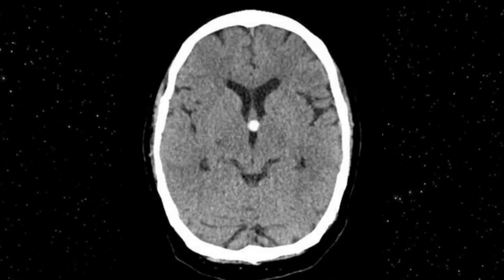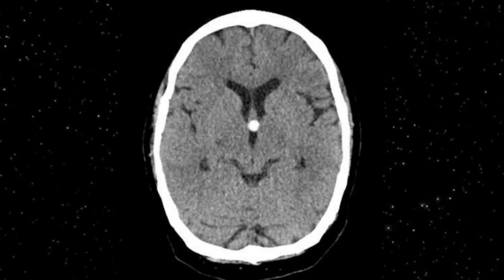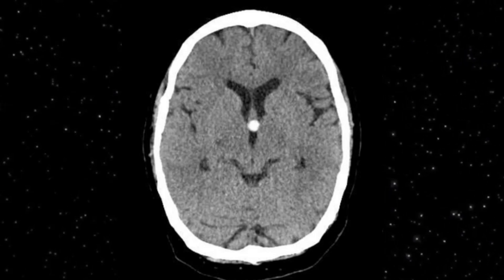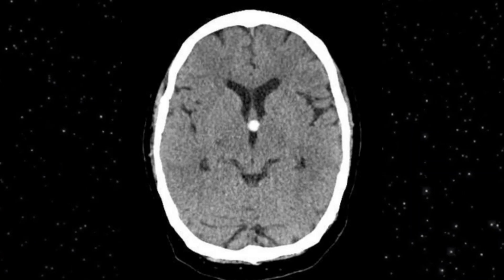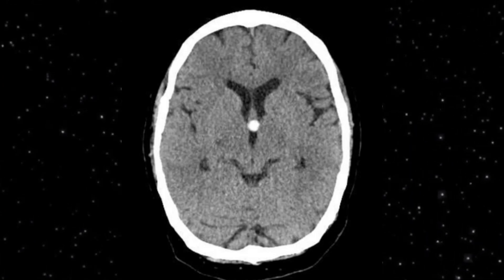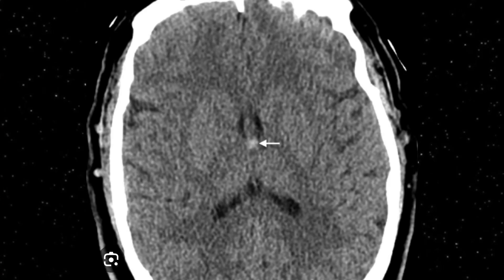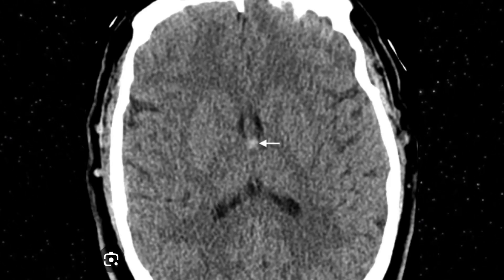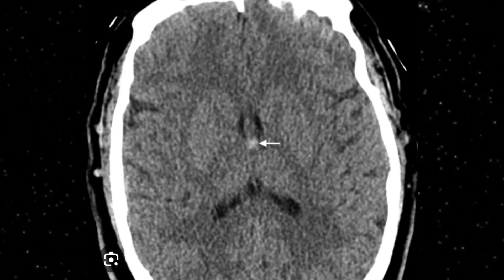On this axial image, you can also appreciate a well-defined, hyperdense, spherical, smooth lesion arising from the third ventricle. However, there is no significant dilatation — the anterior horns of the lateral ventricles are normal, sylvian fissures are normal, and the quadrigeminal cisterns are normal. So there is apparently no hydrocephalus. A very beautiful example of a developing colloid cyst within the third ventricle — a quite clear, very tiny spherical cystic lesion.